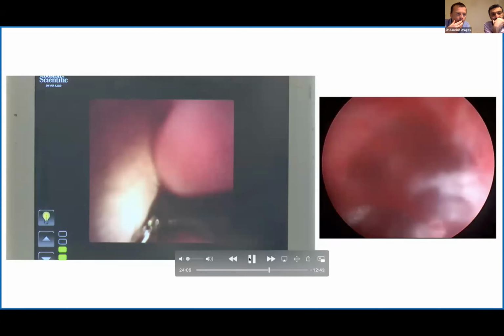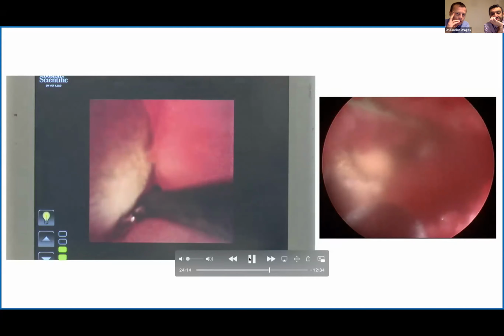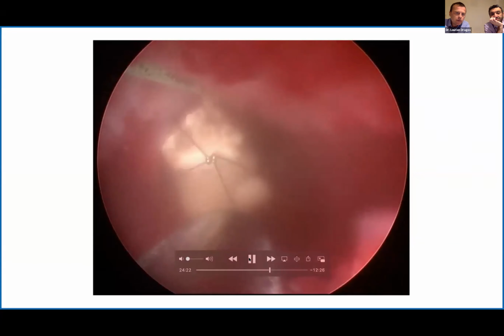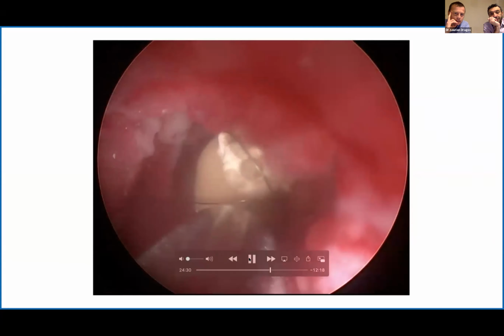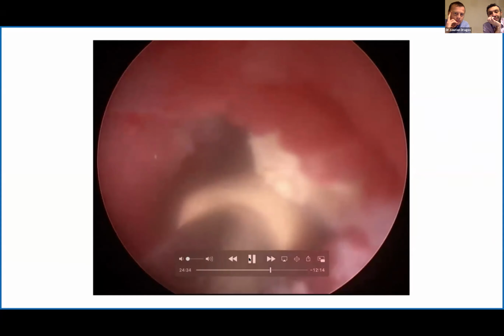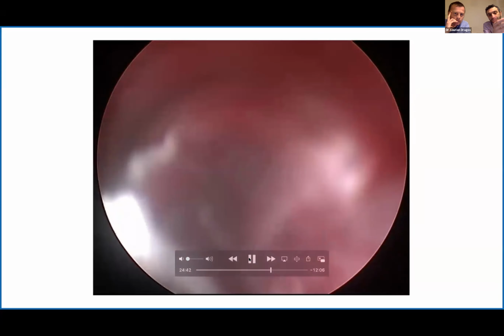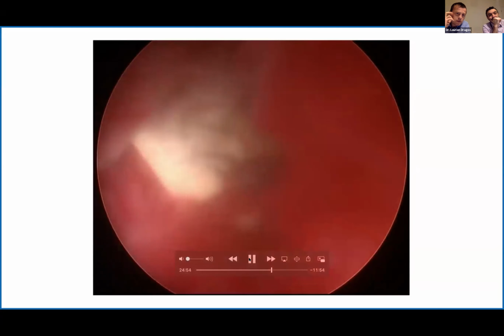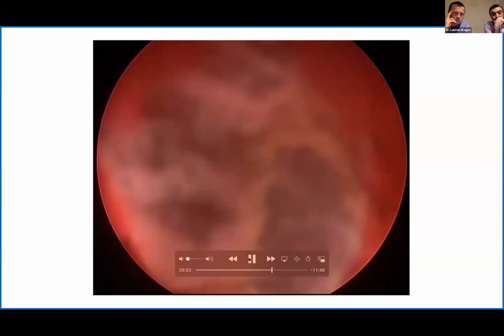If you watch this part, maybe later on, you'll see how long the infundibulum was, and it was, again, not very tight, but tight enough. As soon as I bring the fragments to Kasra, things are getting much faster, much more efficient. And you can see the amount of suction that it's providing. It is collapsing the system, but my concern was how to try and get those stones. What Laurian's doing with the basket is essentially providing a backstop, preventing the retropulsion that we have there. So I think it's almost safe to start sucking and breaking the stone while it's still in the basket. We did it.